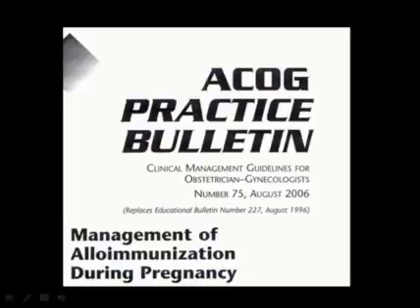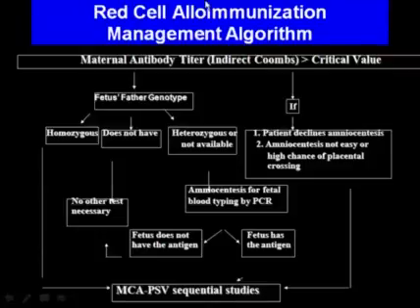Today, the American College of OBGYN has also recognized the middle cerebral artery peak systolic velocity as a good parameter to use in cases of fetuses at risk for fetal anemia. And what has to be the management algorithm of fetal anemia today? I think that it is synthesized here.